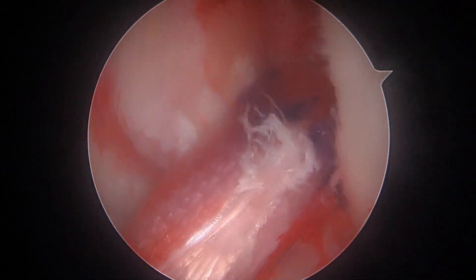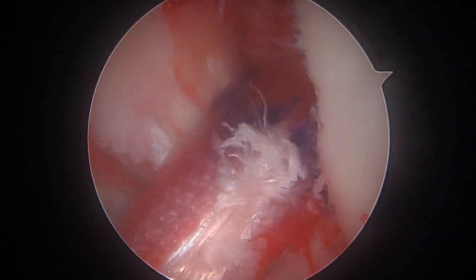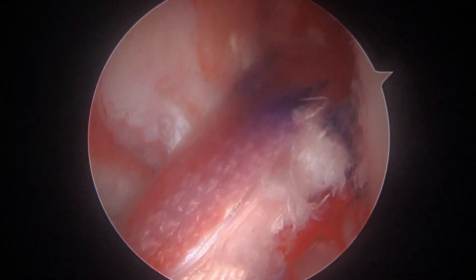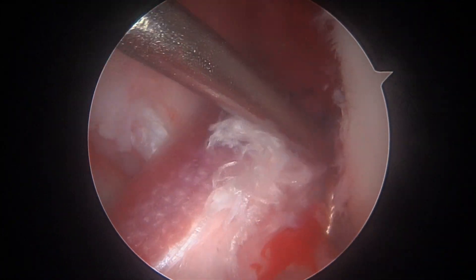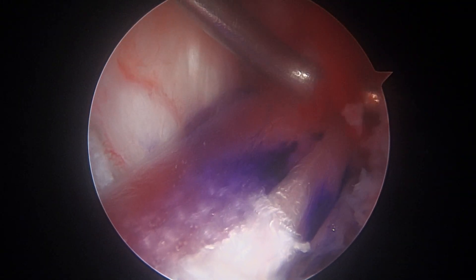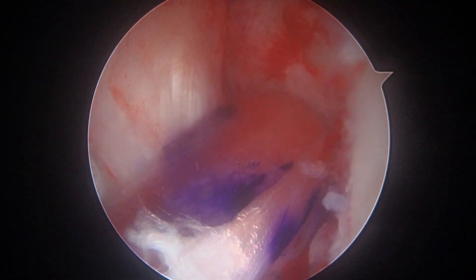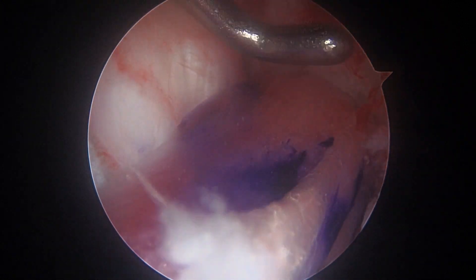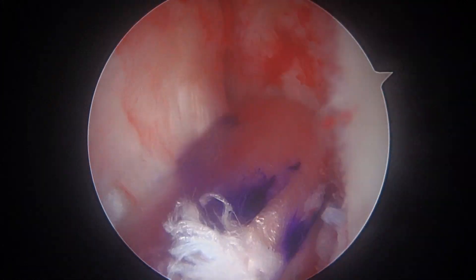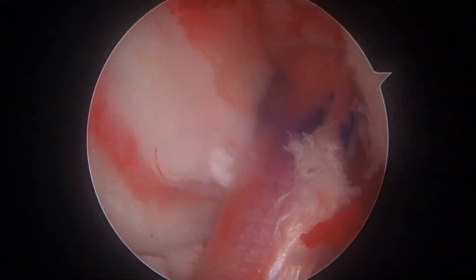So we've got the graft in position. You can see the biobrace on the outside of the graft — this is biobrace right here. We haven't fixed it on the tibia yet, just the endo button's been flipped. I'm very happy with that — that's very solid. I'm pulling real tight on the tibia, but it's not fixed yet; we're going to use a screw. There it is going into the tunnel. That looks great. We're going to go ahead and tension this, and then we're going to put an interference screw in, and then we're going to get you back to the recovery room.